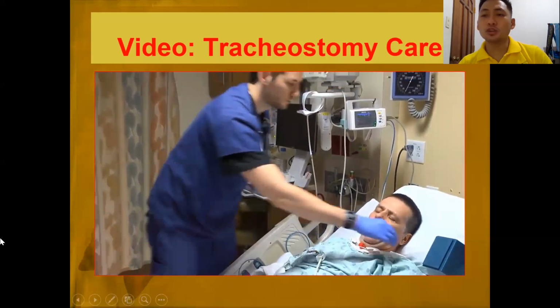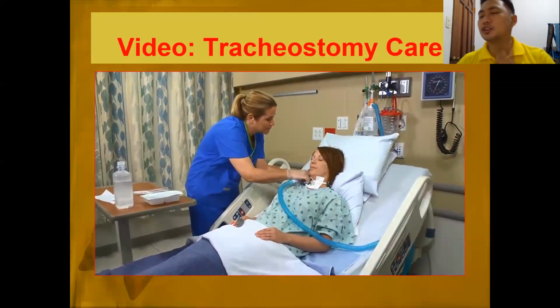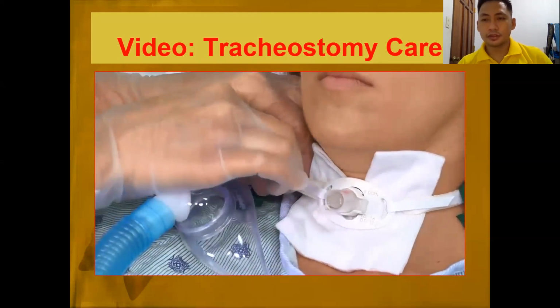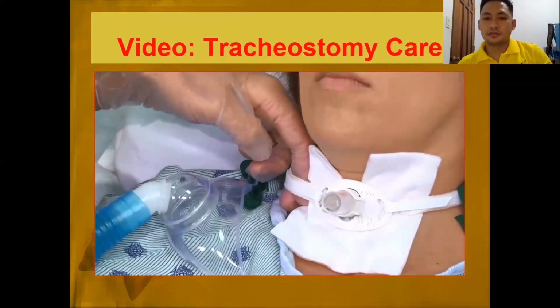So make sure it's not too tight. You can insert your finger para medyo maluwang siya. The neck strap has only enough slack for 2 fingers to fit snugly beneath it, or for 1 to fit loosely. 2 fingers. Ayan.